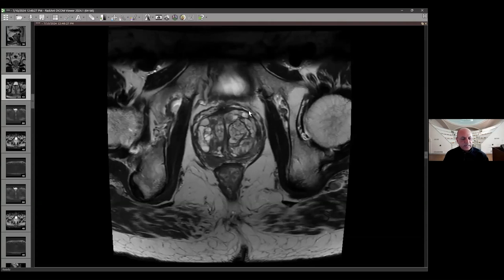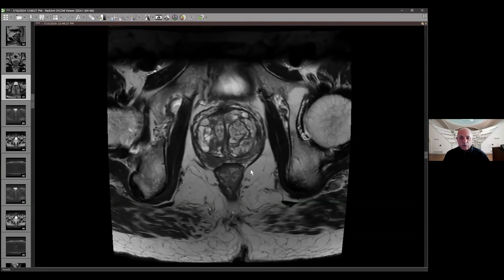So this was a peripheral zone lesion with extracapsular extension. This patient had a low PSA density, yet despite that had a lesion with extracapsular extension — that's the important lesson from this case.